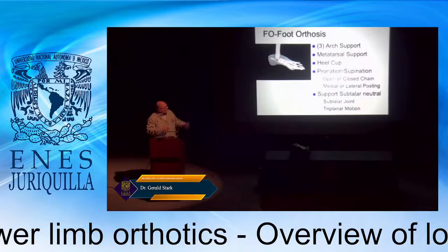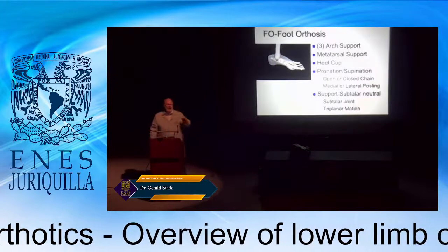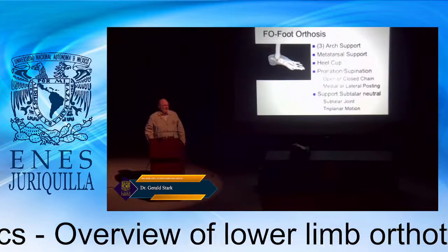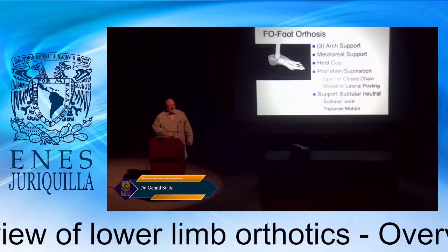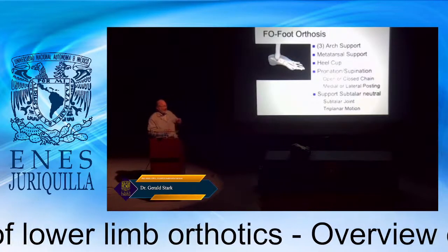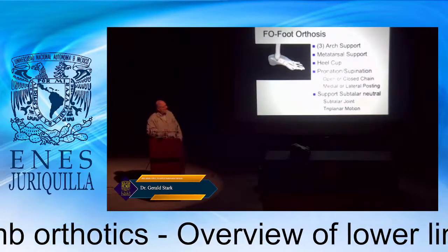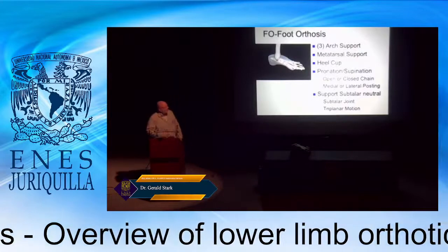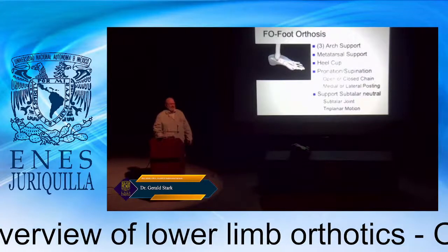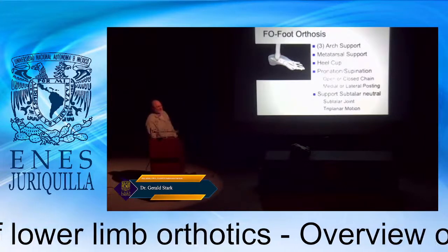The other thing is to provide this heel cupping to maintain the neutral position of the calcaneus under the talus. We don't want to have an inverted or everted hind foot that can actually contribute to the opposite of a forefoot. So we maintain this in open or closed chain positioning. Closed chain positioning means that the foot is flat on the floor. Open chain means when you lift the foot up.